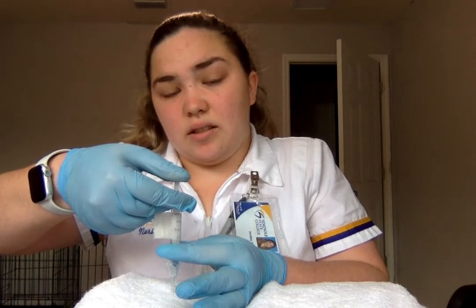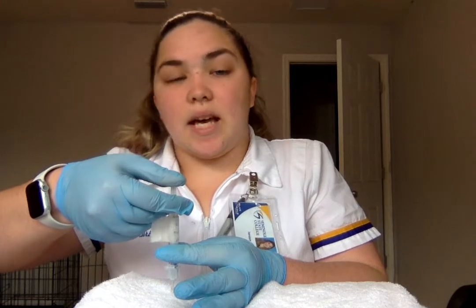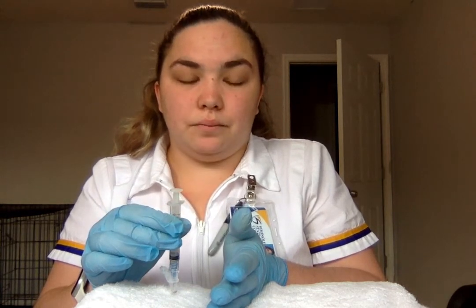Take like 10 seconds to inject it. And then once I have it all injected, I'm going to hold here. I'm not going to pull the needle out. I'm not going to let the muscle go. I'm just going to hold for 5 to 10 seconds and let it absorb into the muscle. Then once I wait 5 to 10 seconds, I'm going to quickly pull the needle out.